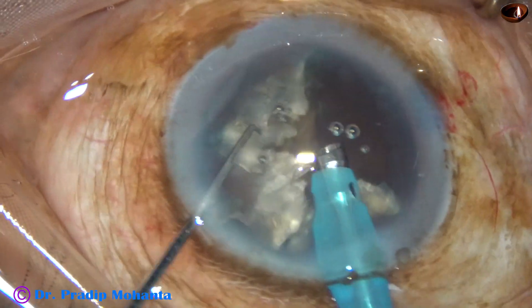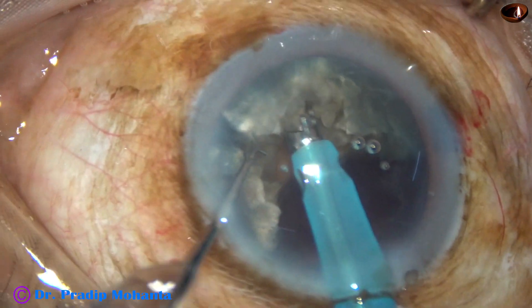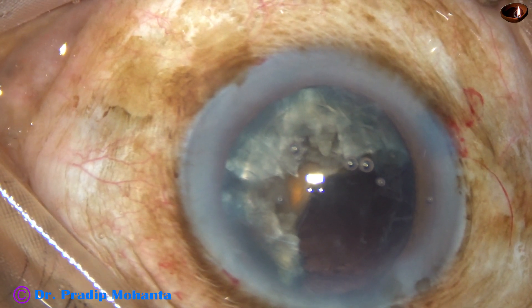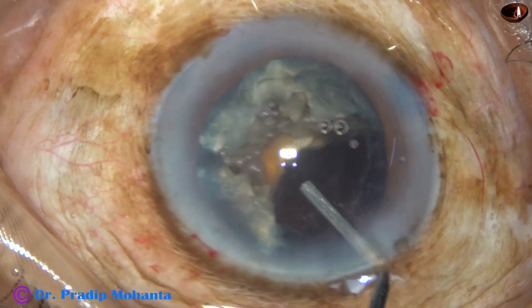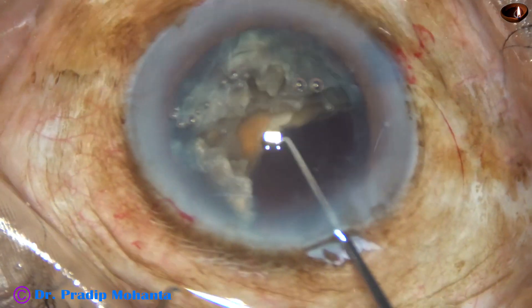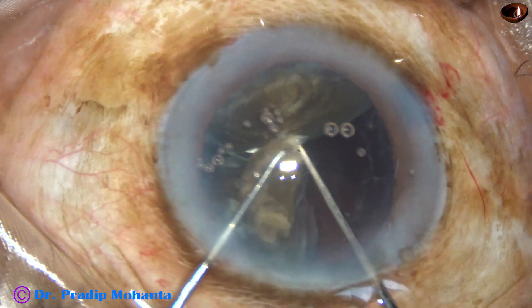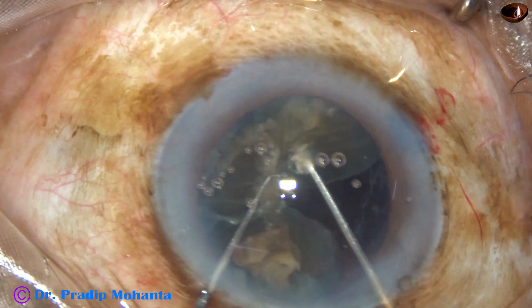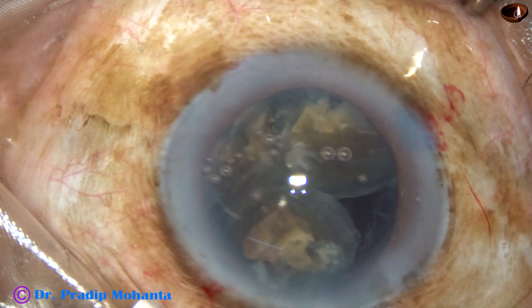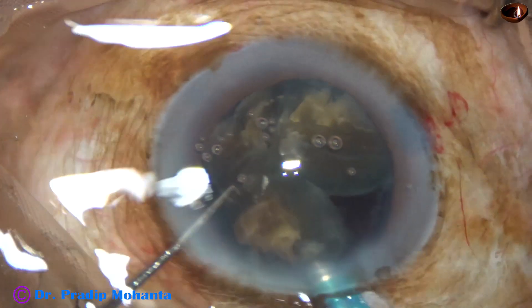The small heminucleus with two fragments has been emulsified. And now, I turn the bigger heminucleus with three pieces — the pieces are still attached to each other. I try to tilt it, but it was not possible. So I come out, inject visco, inject visco behind. And now I take my blunt chopper, go behind this mass, lift it up, tilt it, use the Sinskey hook from above, and it is done. All the pieces are free. I go again with the tip of the phaco needle and start emulsifying these three fragments.